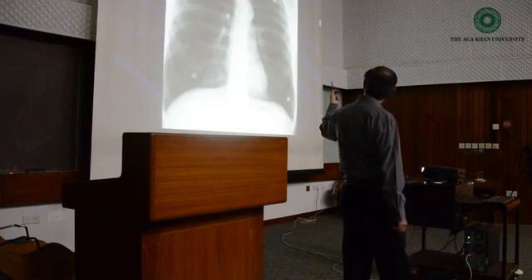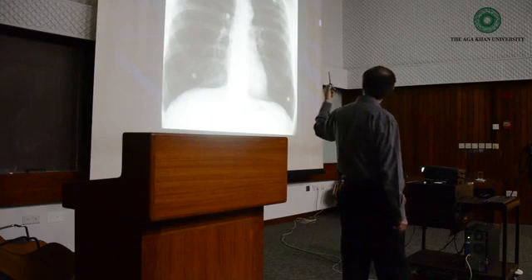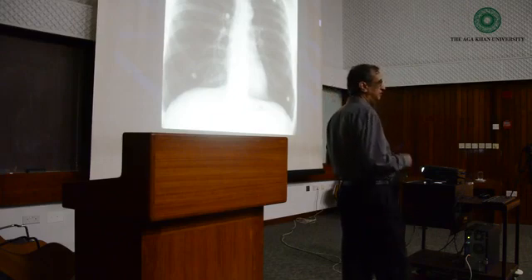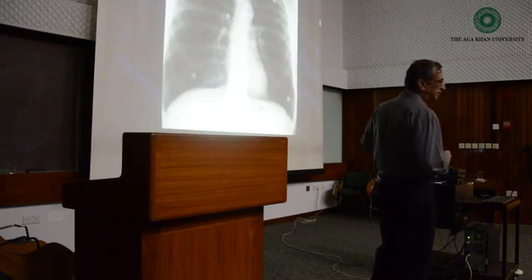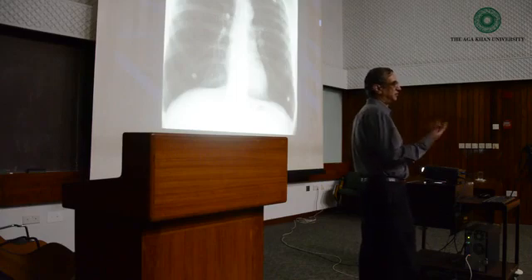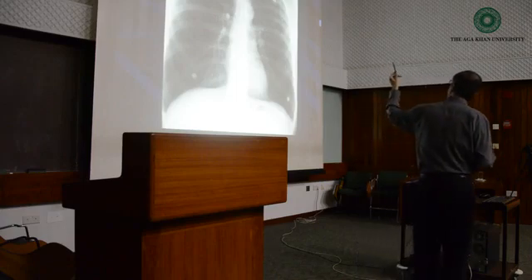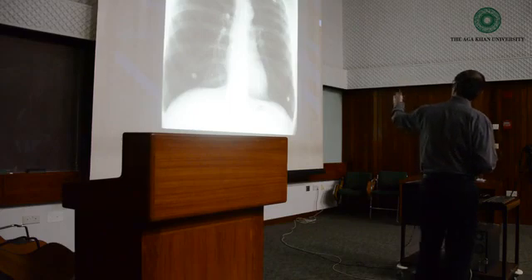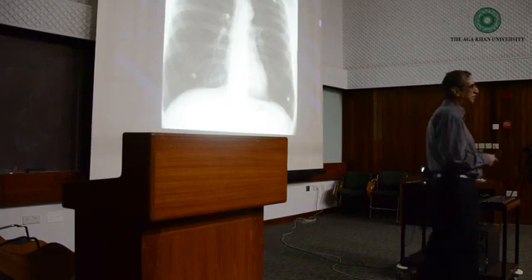And you actually try and position the person in such a way that there is no rotation. But if there is non-compliance, won't the other side reduce? When one goes away, the other comes near the midline, so it doubles the effect. If 1 centimeter rotation to the right makes this come nearer, and this go 1 centimeter away, the total effect would be 2 centimeters.